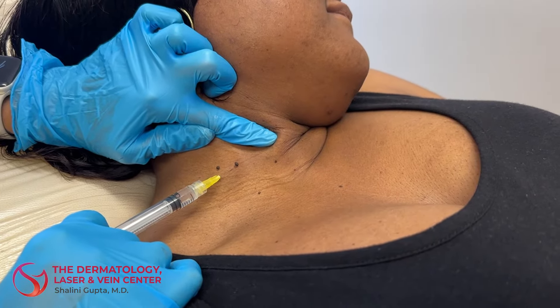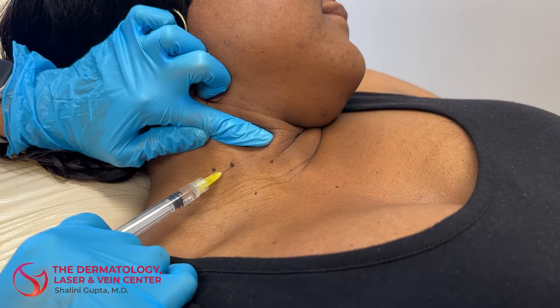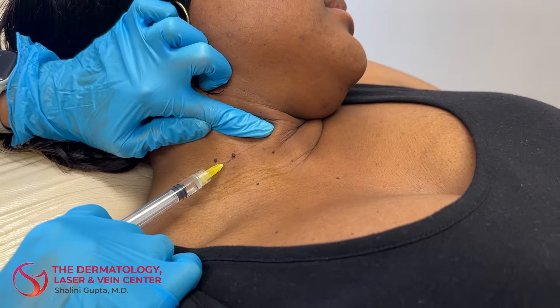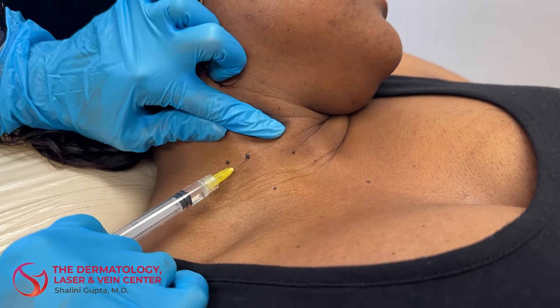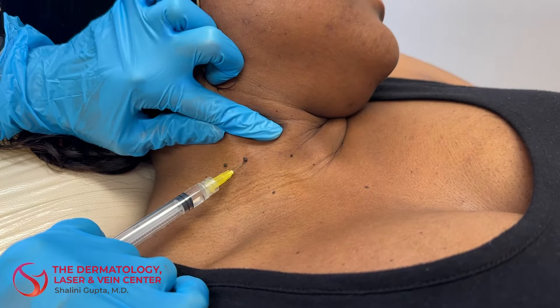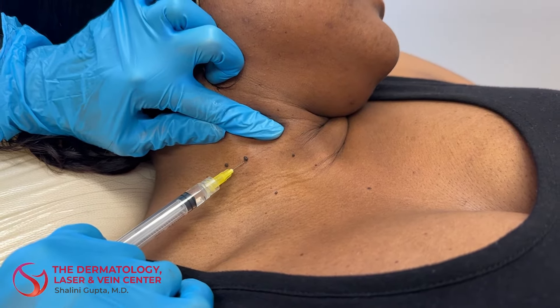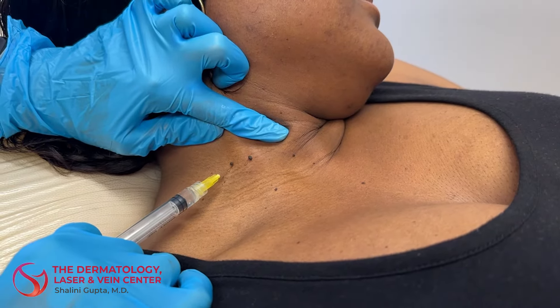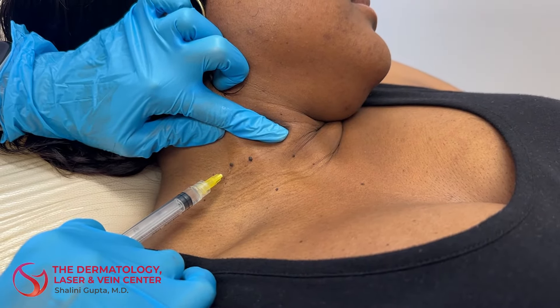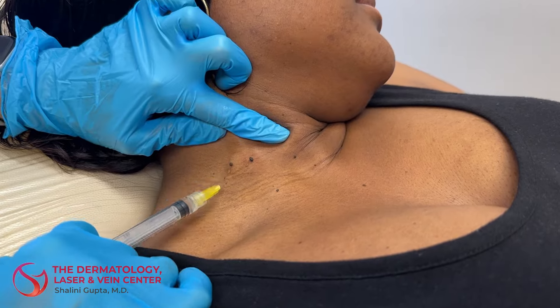Hey everyone, it's Dr. Gupta at the Dermatology Laser and Vein Center, and here I am removing a couple of skin tags. I'm numbing the skin first using lidocaine with a little bit of epinephrine so that there's minimal bleeding from the procedure. And once the skin is numb, the patient will not feel me removing the actual skin tag.